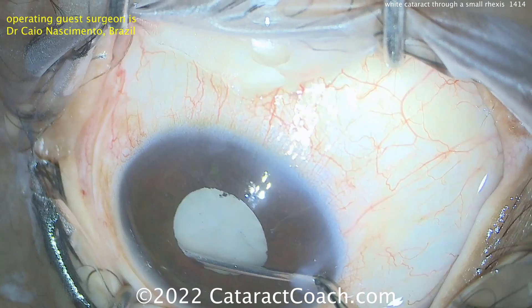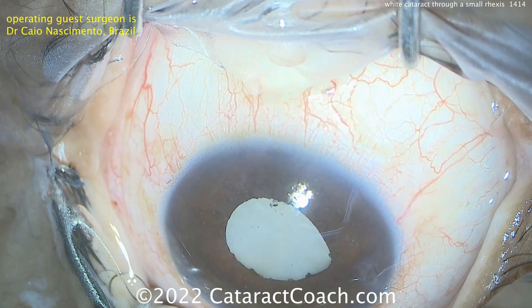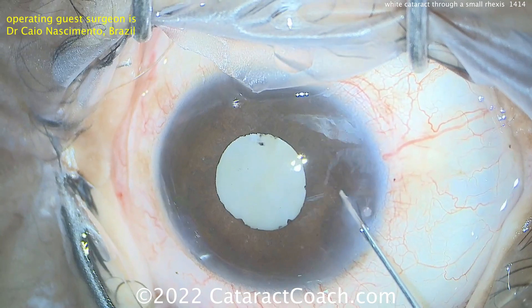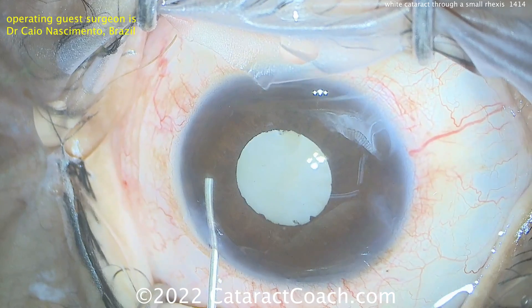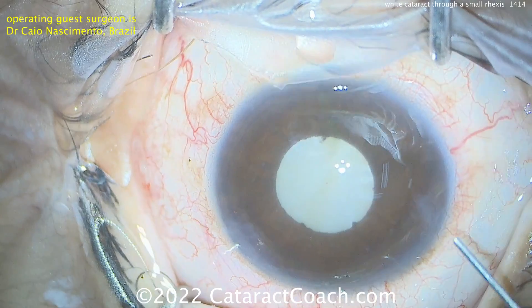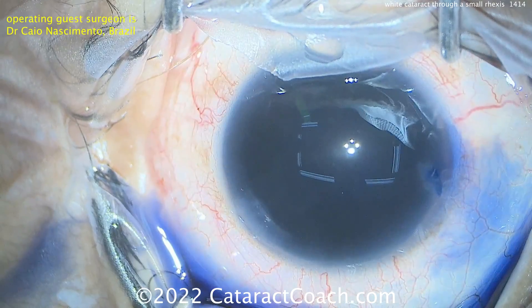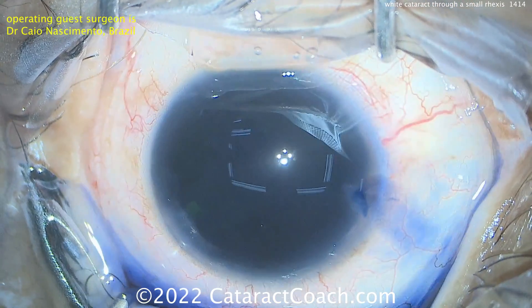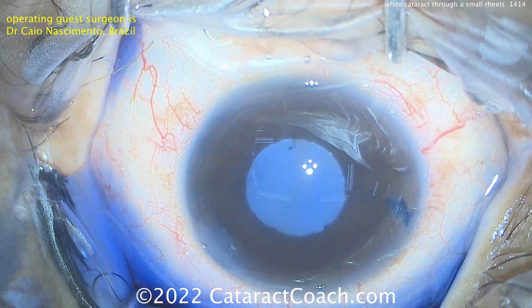Just a sweep with that cannula looks to be sufficient to break the synechiae there, and that's broken too. Now in a case like this, I would tend to stretch out the pupil and then make a significantly larger capsulorhexis — I'd aim for a 5mm rhexis. But in the case being presented here, Dr. Nascimento is just going to do a rhexis within the confines of the pupil. Certainly that works; it just makes the surgery a little bit tougher. So trypan blue dye going in to stain the anterior lens capsule. Now a lot of surgeons would also use a pupil expansion device — maybe a pupil ring, maybe iris hooks — something of this nature to help open up that pupil.